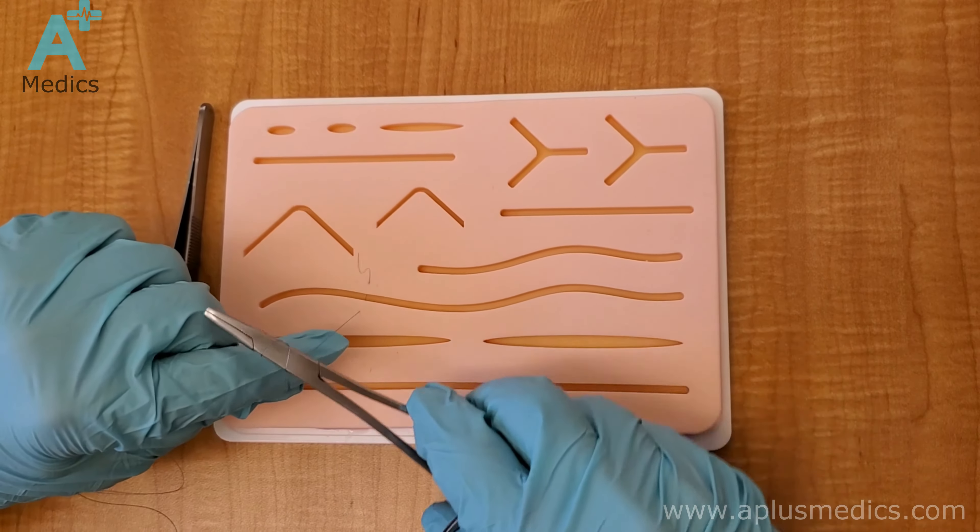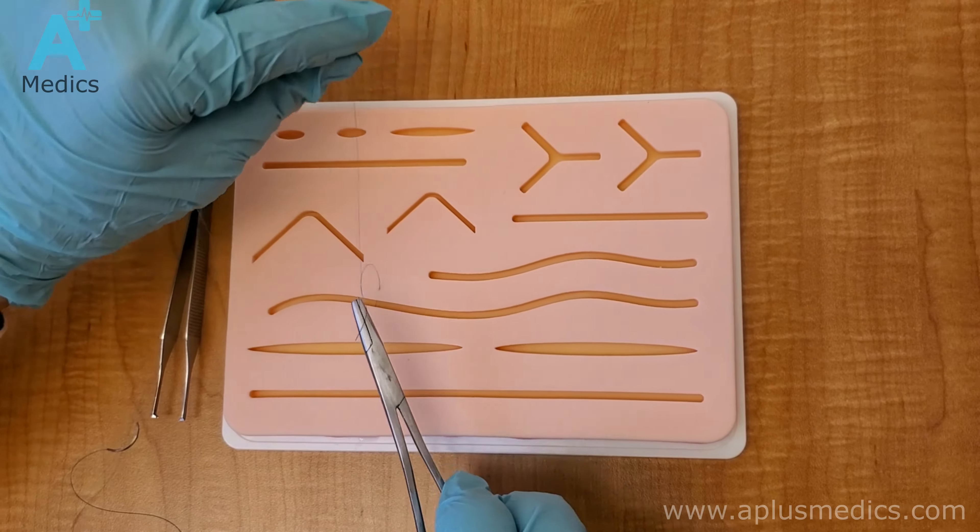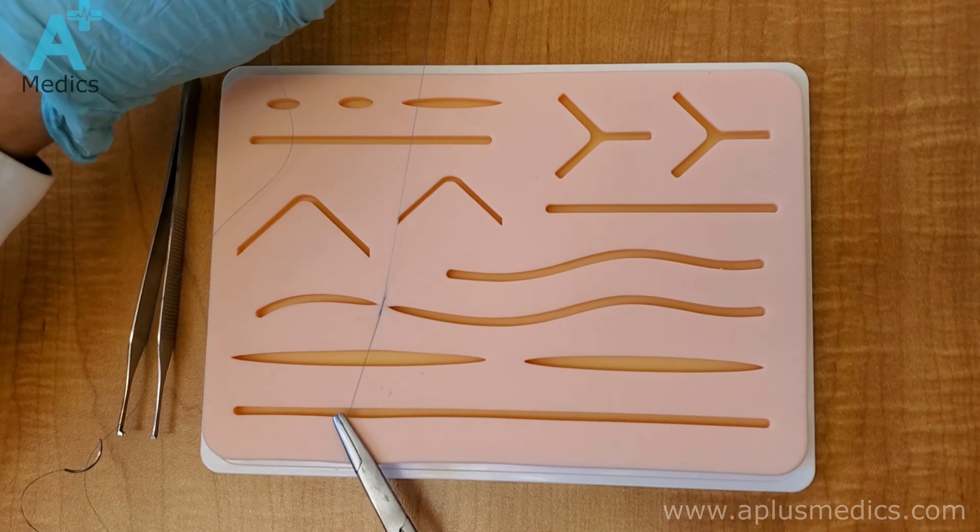Wrap around twice for a surgeon's knot — that is a surgeon's knot by definition, you wrap around twice. Then pull the short end and pull your hands on opposite sides just like that.